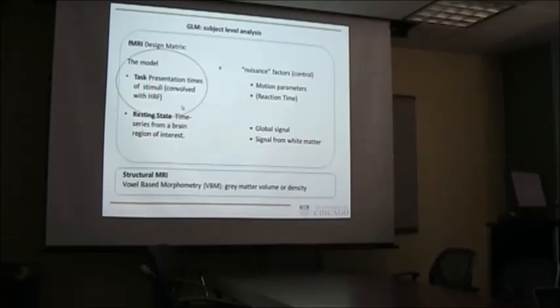And you can even do, also within the task framework, analyze the interaction between the response in a region and the task related activity. You get a PPI model. It's all more advanced analysis. The basic is task fMRI, but it's good to realize that the setup is really similar, whether you do task fMRI, resting state, or some task connectivity. Right, you're always trying to fit this model.